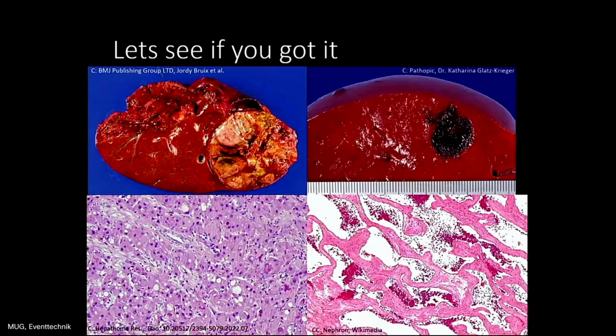On this image, you see a blackish, spongy, soft lesion, again in the liver. And this is the hemangioma of a liver. And in the histopathologic image, you see connective tissue, you see huge caverns filled with erythrocytes, and you have a lot of change.